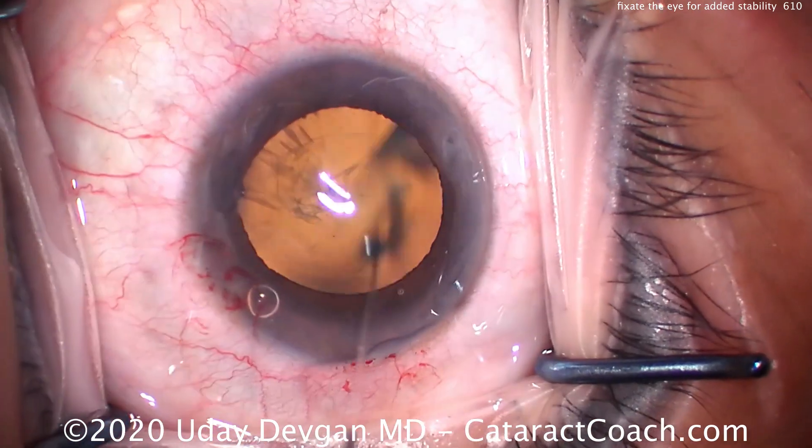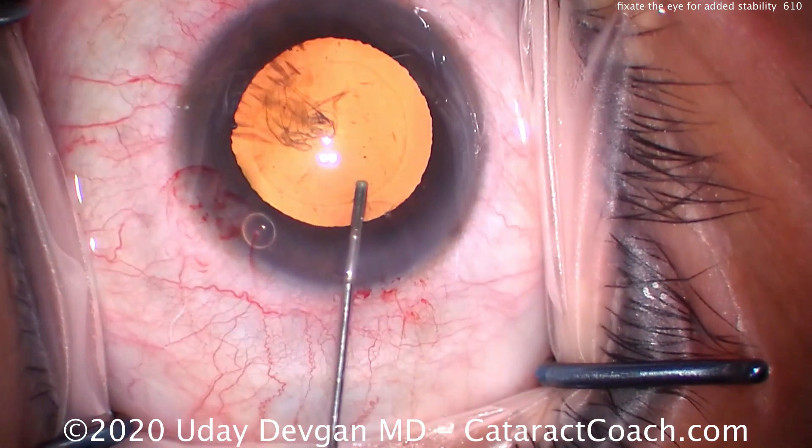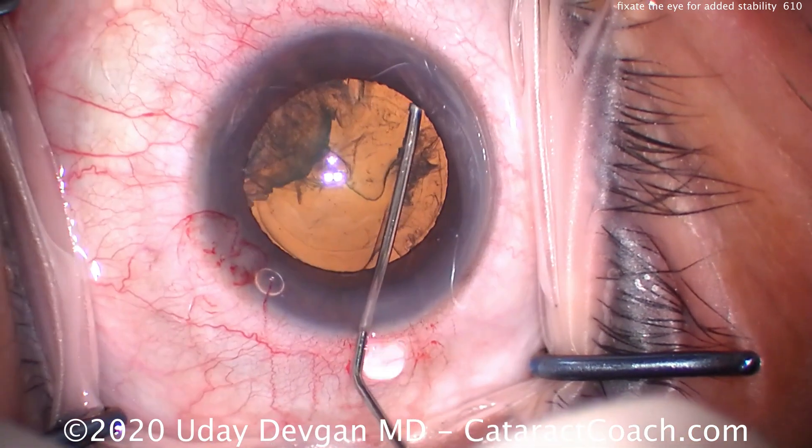Now at this point, the patient's eye is a lot more cooperative and the patient is able to look at the light and help us fixate.